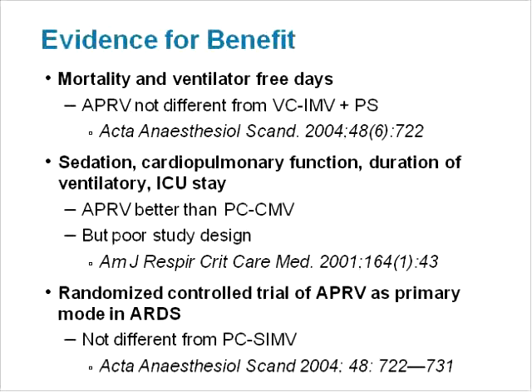Now, the current generation of ICU ventilators offer a number of adjuncts that can be applied during APRV. The mandatory breaths, that is T-high and P-high periods, can be synchronized with the patient's spontaneous breathing efforts. While this seems a reasonable way to improve comfort, only one study has been done using simulated breathing with inconclusive results.